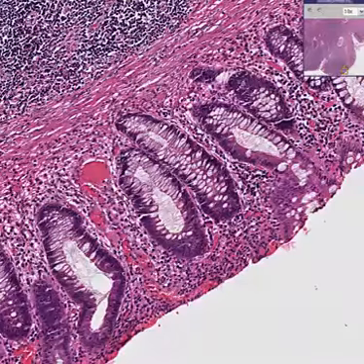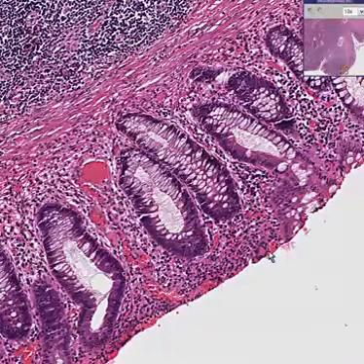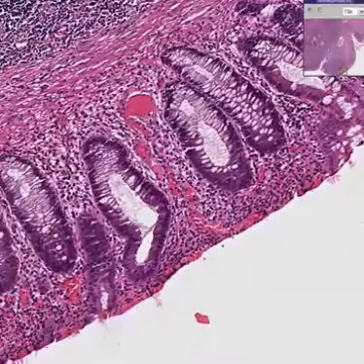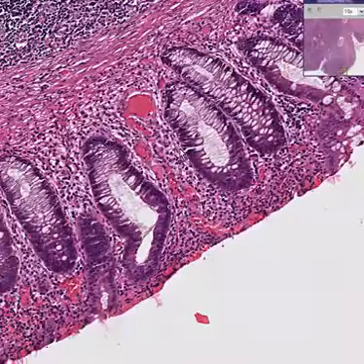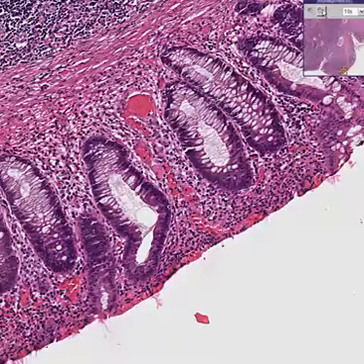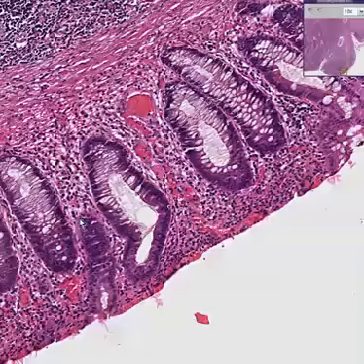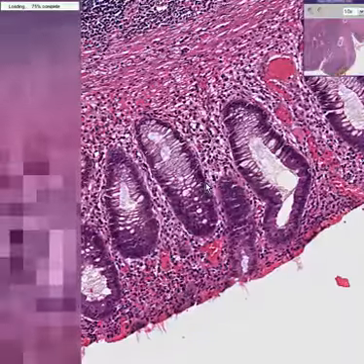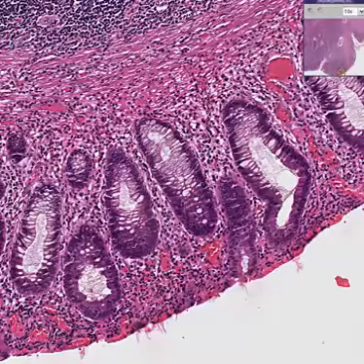here in the areas of inflammation and ulceration to make you think that, gee, it looks a little bit atypical. And the point I want to stress with you is that long-standing ulcerative colitis is often associated with atypia and also, therefore, associated with the increase of likelihood of carcinoma.